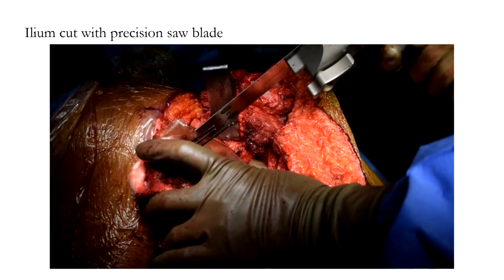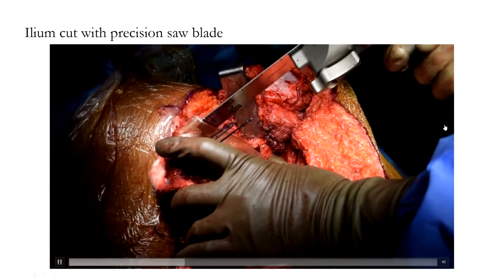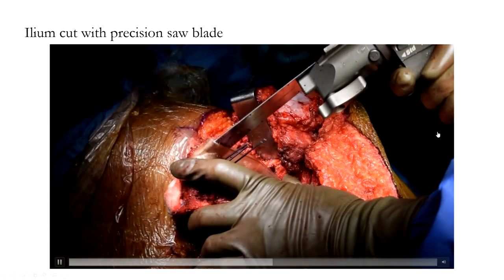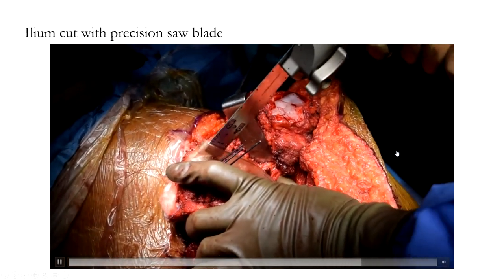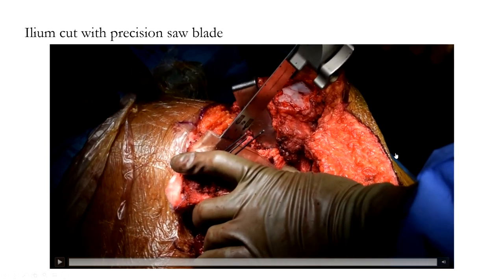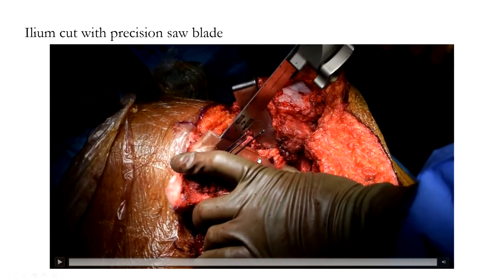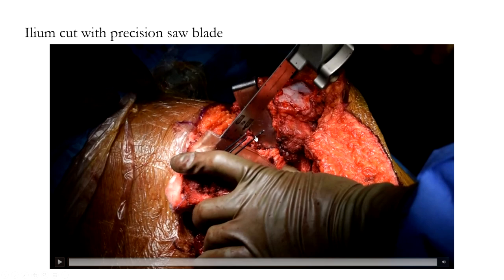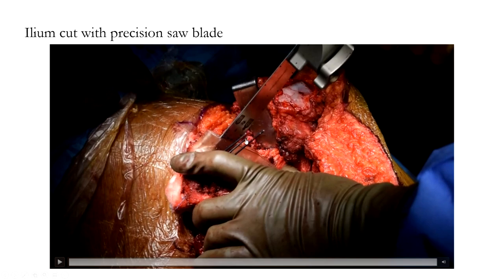The ilium was then cut with a Stryker precision saw blade, which minimizes oscillatory movements. The jig was designed so that the precision blade snugly fit into the cutting slot to cut the ilium. The jig was fixed to the native ilium using three K-wires.